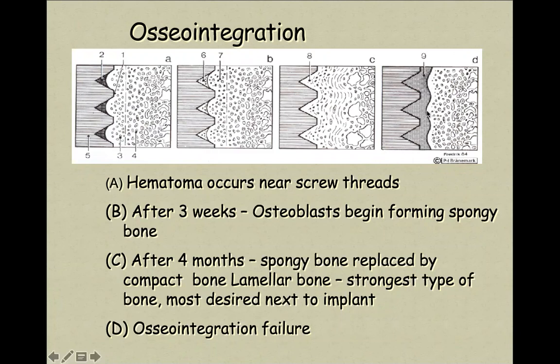As you can see, there's bone here, there are threads here, and in between we have granulation tissue, or sometimes, if the time after the first step is more than 2 or 3 months, fibrous tissue. Usually it is painful.